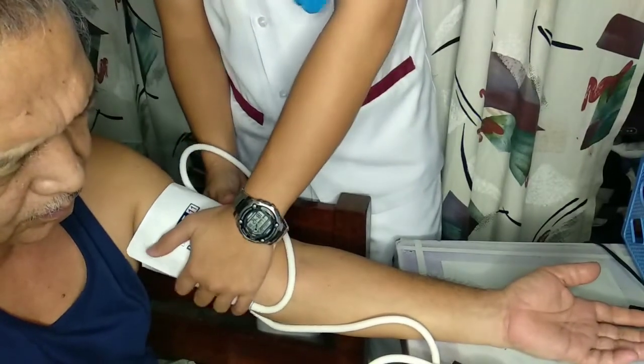So this is to avoid unnecessary inflation of the cuff that would cause discomfort and pain to your patient. It also avoids occasional errors caused by your auscultatory gaps, a silent gap between your systolic and your diastolic pressure. After you have taken note of the estimation of your systolic blood pressure, you deflate the cuff and wait for at least 15 to 30 seconds before taking the blood pressure.